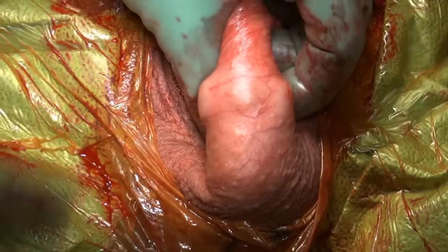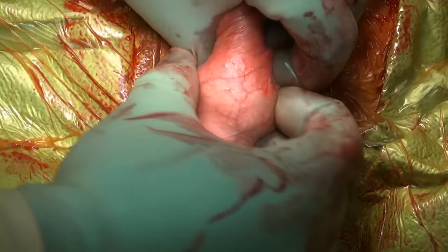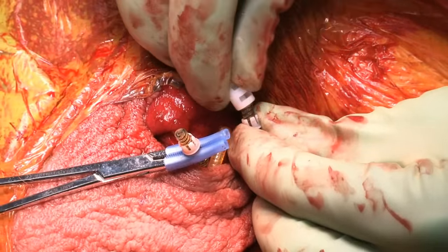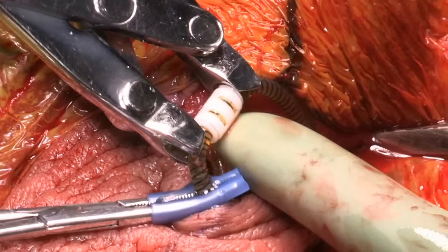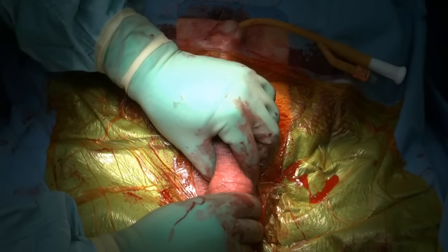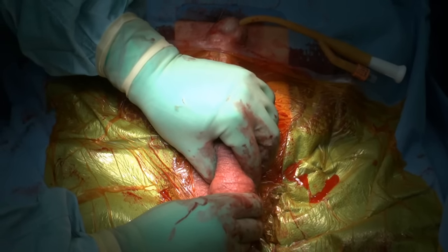Here's our position. The bulb and the deflation button are easily palpable with the pump in this position. We connect the tubing using the AMS Quick Connect Sutureless Window Connectors. Once connected, I prefer to do an inflate-deflate test and do a final inspection of the device.